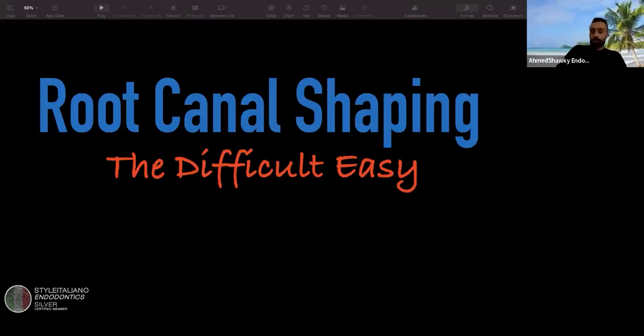Let's go into our topic today. I hope I didn't make it long. Root canal shaping, I consider it the difficult easy. Why is it a difficult easy? Because in theory, it's easy. You determine your working length, you go with the file, shape the root canal, rinse the root canal, obturate the root canal, and put your coronal restoration.